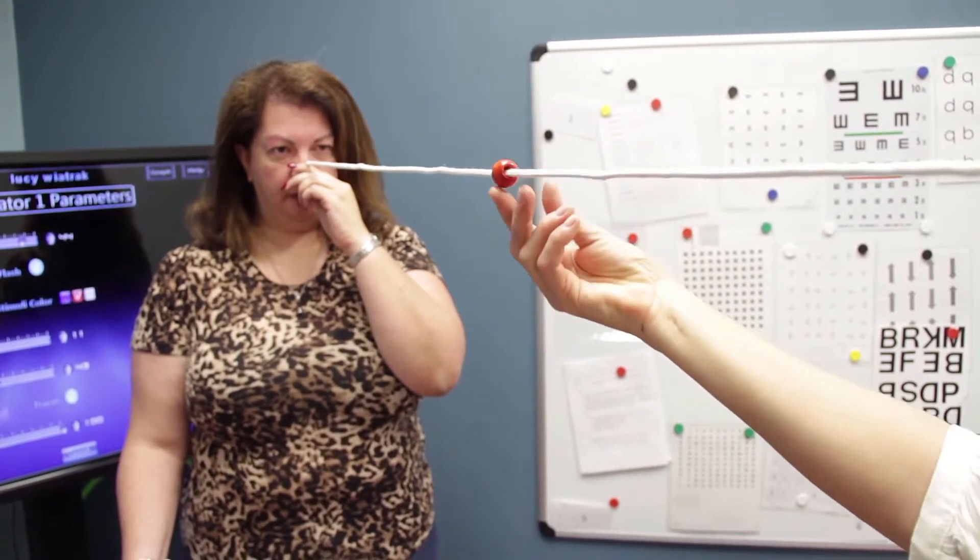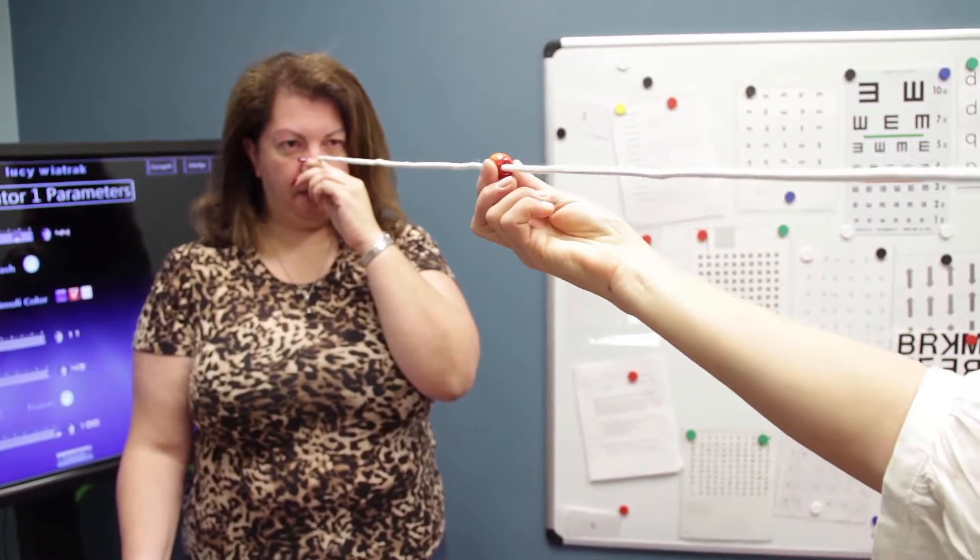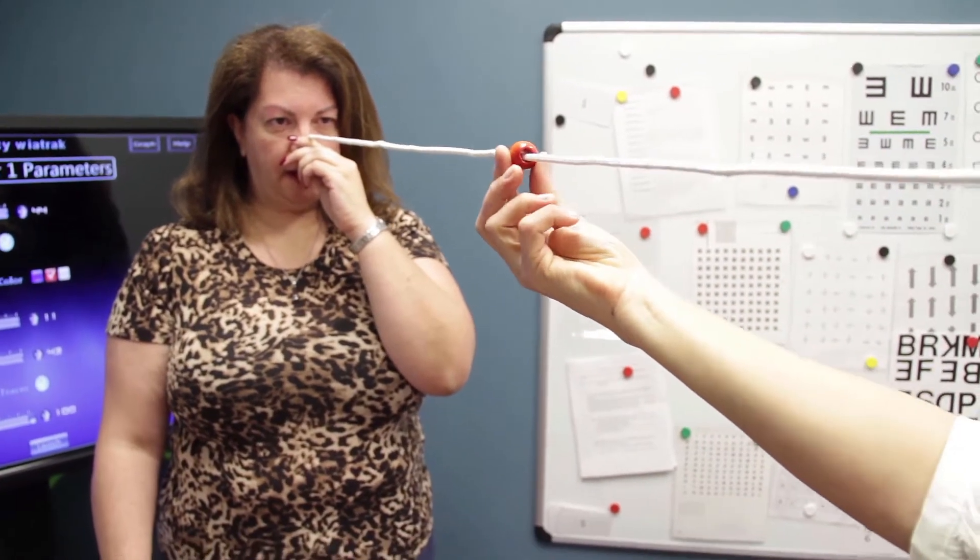Okay, so tell me when you get it back. Okay, go. Keep going. No, go the other direction. So you have it now? I have it.